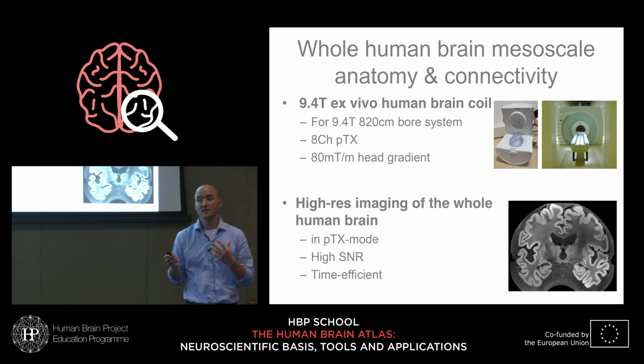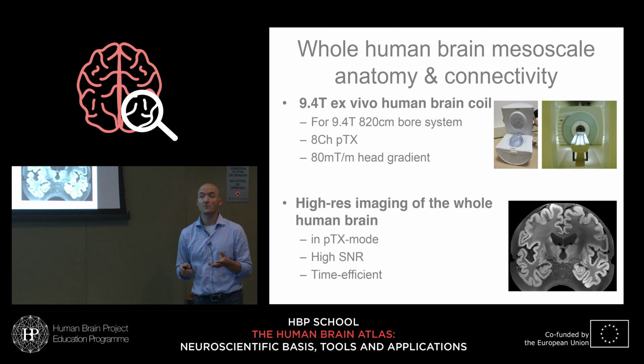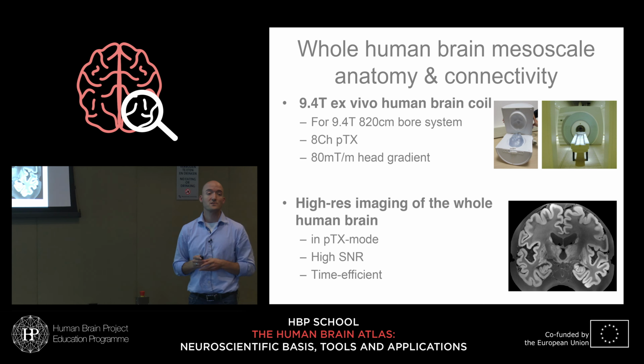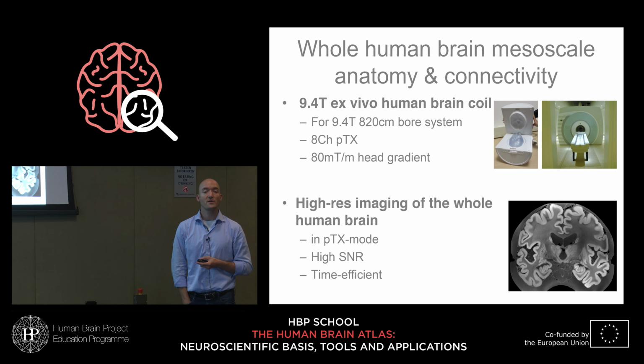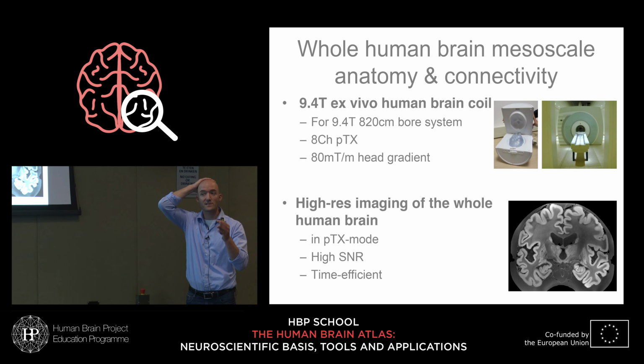Also, an aspect that I won't mention so much, but that also gets a lot of work, are the pulse sequences. The sequences that we run on ex vivo brains are totally different from the ones that you run in vivo, because the ones in vivo, frankly, just don't even work. You have to go to a very different way of scanning. For one thing, you have a very low duty cycle when the post-mortem scans that we do run. You'll hear tick, tick, tick, tick, tick.